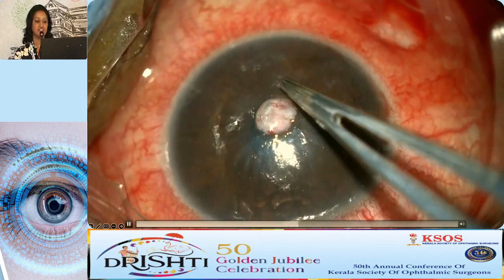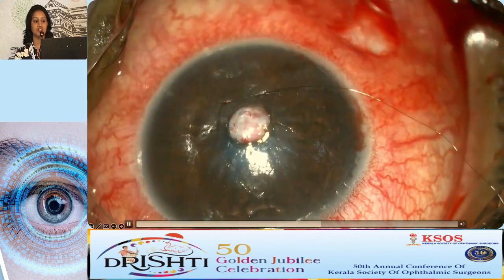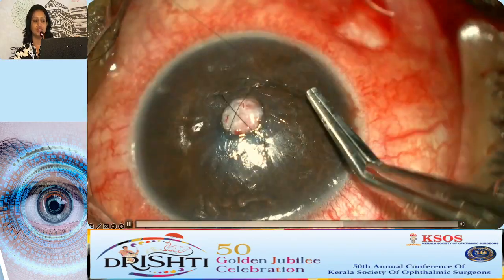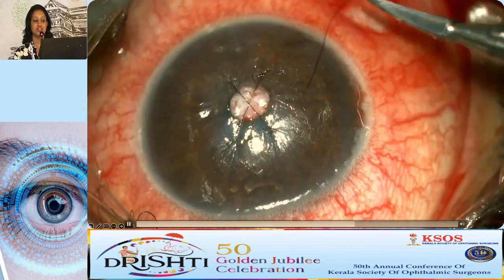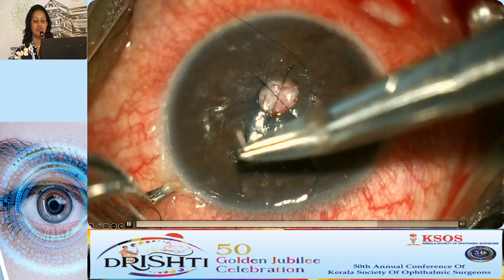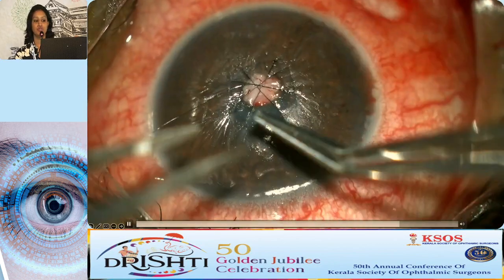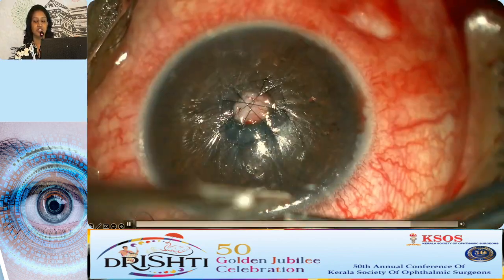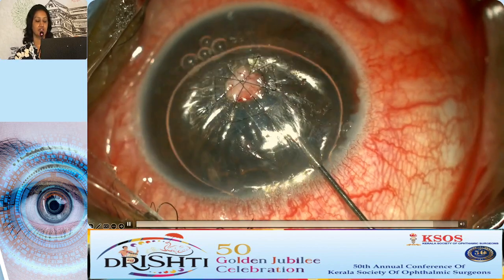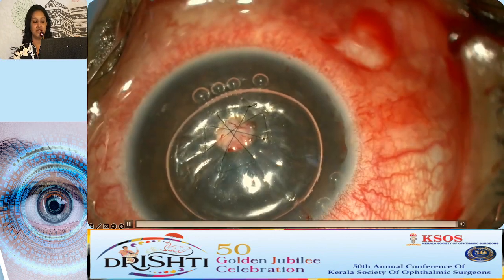And once you have fixed it with the fibrin glue, you can take overlay sutures, which are more in a box shape, to just hold the tissue in place. One must remember that this does not create a watertight anterior chamber. And while reforming an anterior chamber, make sure you don't form it to the full extent, and probably leaving it back as a soft globe would be the best thing to do. So now we can see that the air bubble is complete and the AC has been formed.